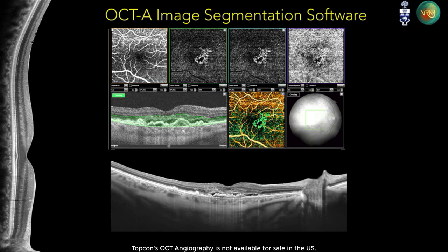So here's an example of a patient with a CNVM from wet AMD, nicely delineated here. This is no post-processing, no post-editing from my side on the segmentation. Very clear view of the CNVM that's shown up here in the outer retinal slab. And obviously down below, you have a beautiful long OCT line scan, which shows you the degree of impairment of the anatomy.